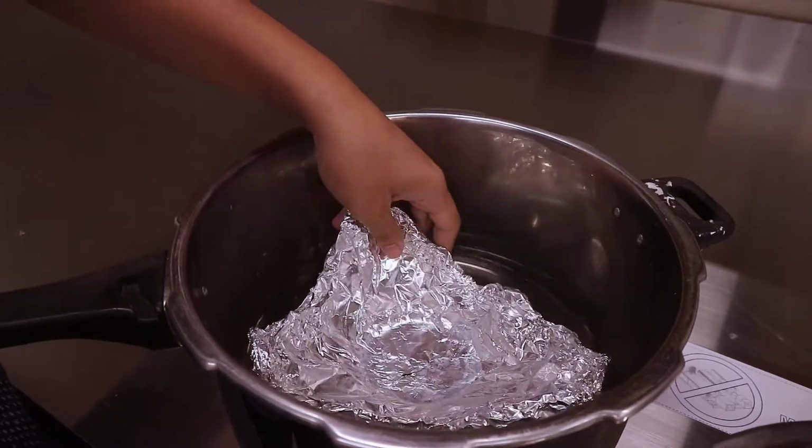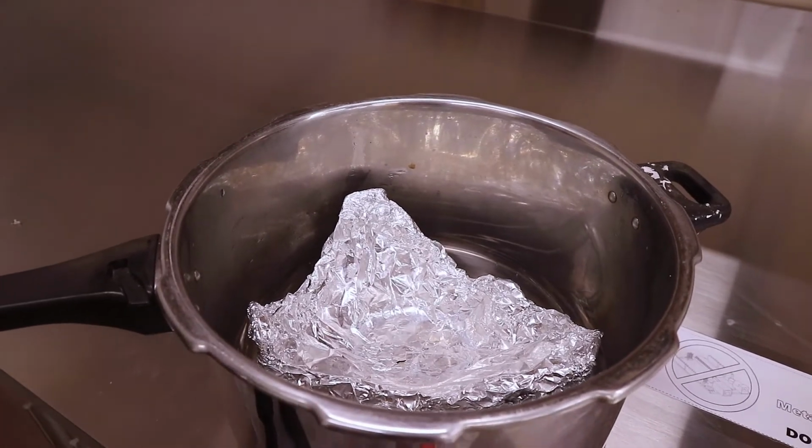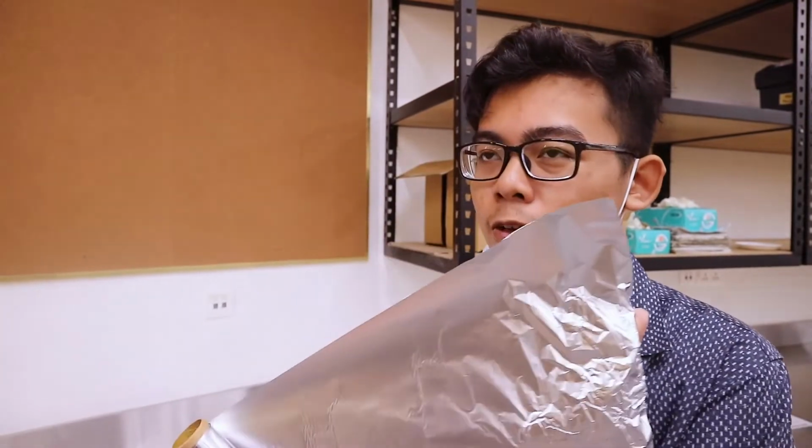Actually, people say that you can use this without water, but we prefer to use water because of aesthetic reasons. I don't know, it's just our decision. We want to make sure that there's vapor, there's something to signal the ending of the cooking process. So this will not be vacuum, it has water, so the pressure cooker will cause a noise that sounds like a bomb. After stirring the solution for 2 minutes, we will want to cover the beaker with aluminum foil.